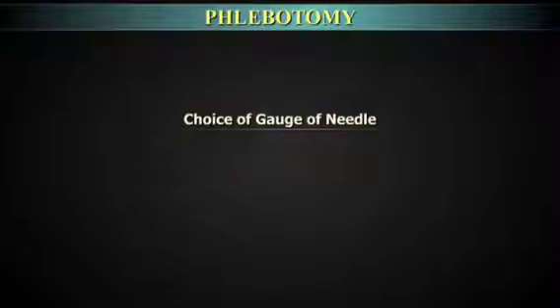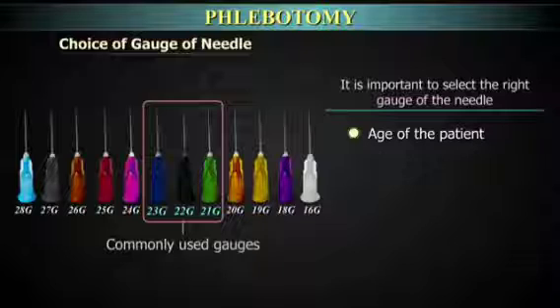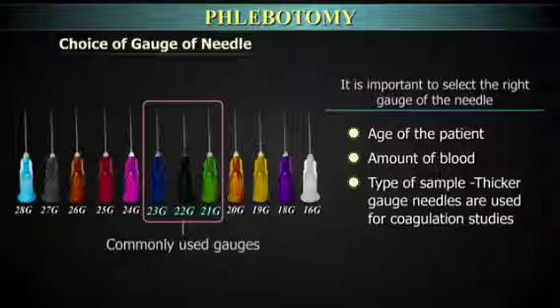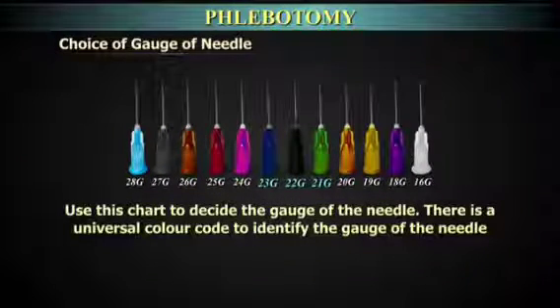Selecting the gauge of needle. It is important to select the right gauge of the needle based on the age of the patient, amount of blood, and type of samples. For example, thicker gauge needles are used for coagulation studies. Use this chart to decide the gauge of the needle. There is a universal color code to identify the gauge of the needle.